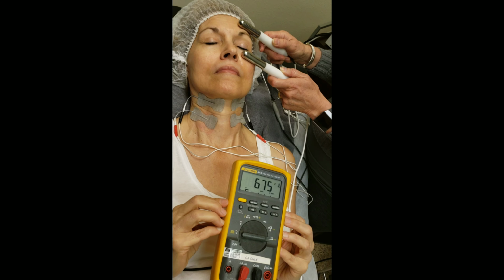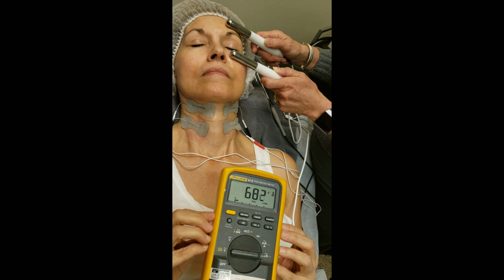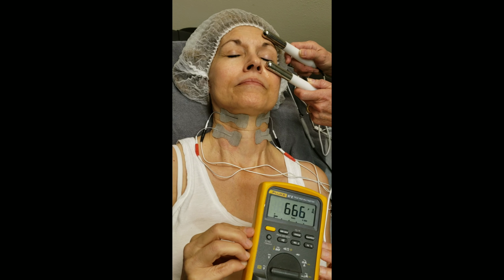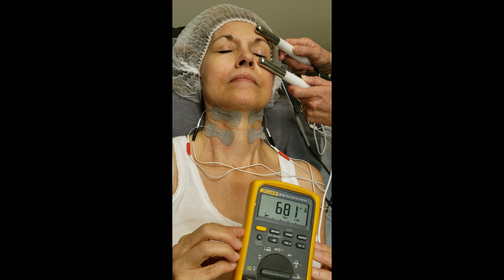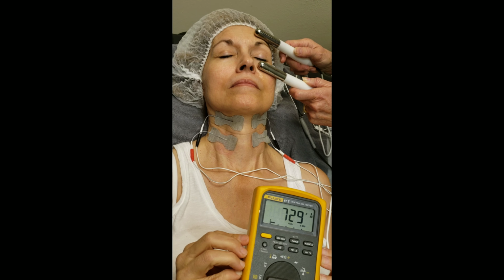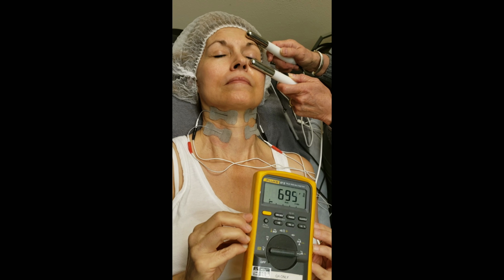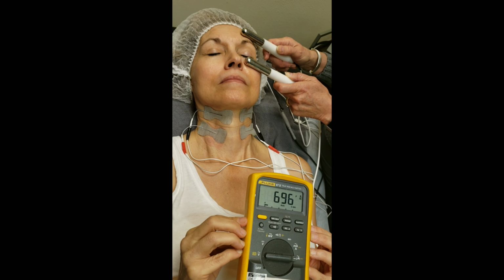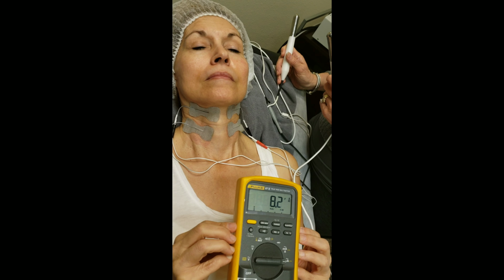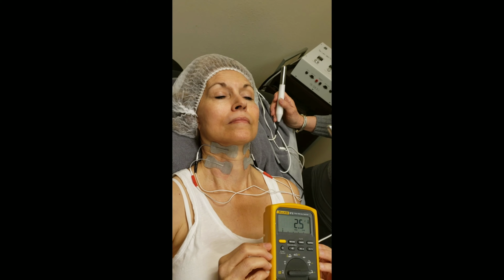So based on the probes and the pads all connected, you can see the importance and the significance of impedance monitoring, because the more ports that you're using and the more skin surface area you're covering with your output accessories, you're going to need a device that is going to monitor and measure that so that we can get the proper levels. And that's how it works. So you can see the significance of that.